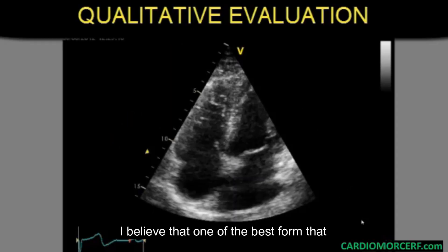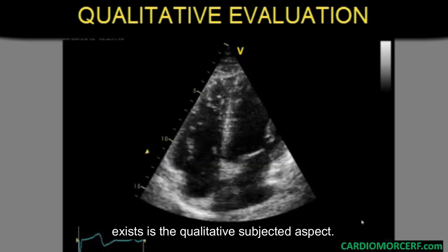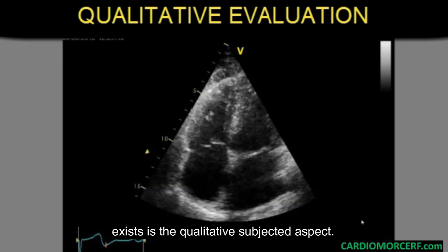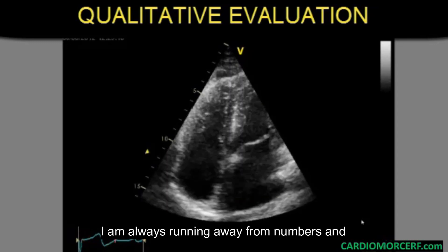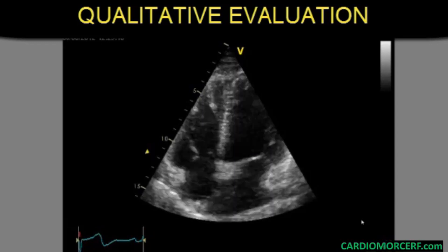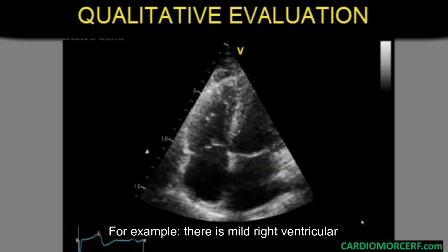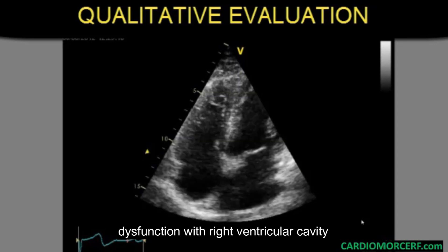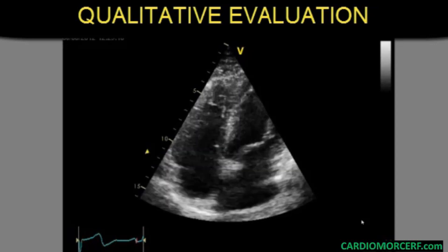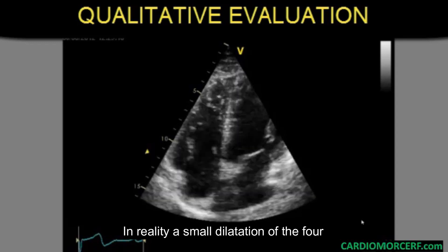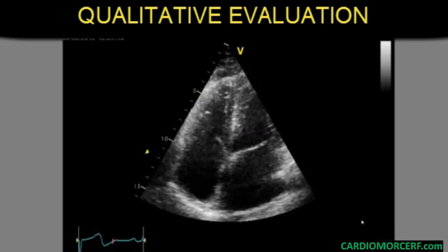I believe that one of the best forms that exists is the qualitative, subjective aspect. I am always running away from numbers and equations. For example, there is mild right ventricular dysfunction with right ventricular cavity increase — in reality, a small dilatation of all four cavities.